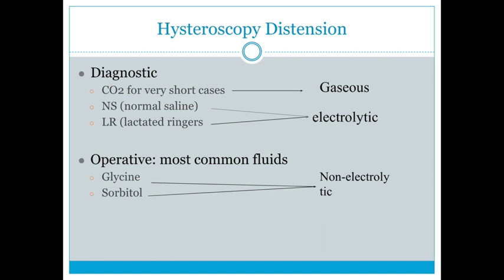If an operative hysteroscopy is performed, glycine or sorbitol are the common fluids used. These are both non-electrolytic fluids that are safer to use when the bovie is utilized. Other less common non-electrolytic fluids are glucose, mannitol, and dextran.